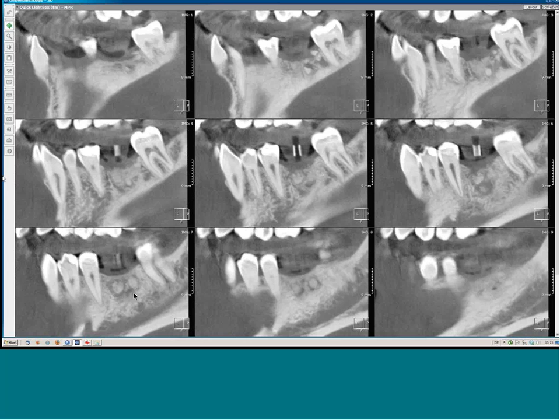So if you don't know exactly if there are any socket preservations, just ask the patient, or figure this information out from the colleague who has done it before. It might be really critical to differentiate between socket preservation and root rests.